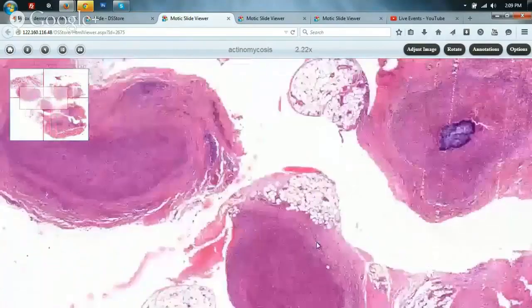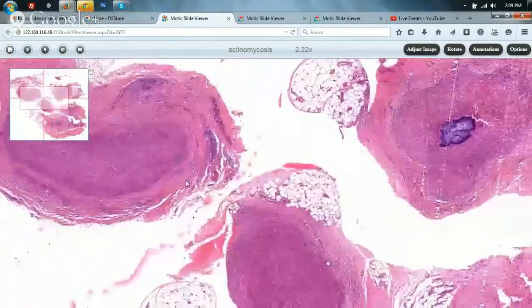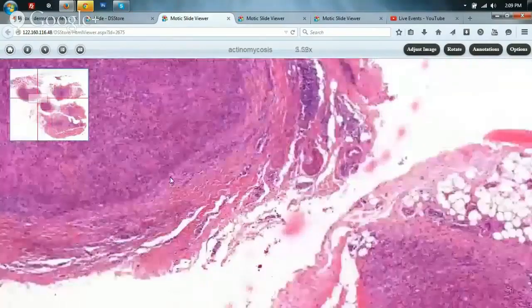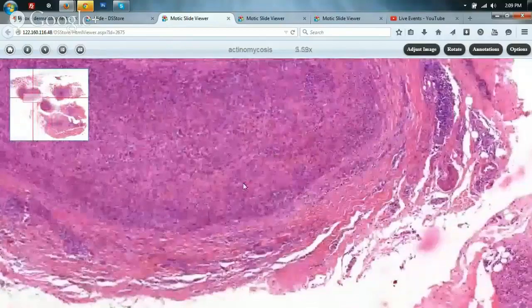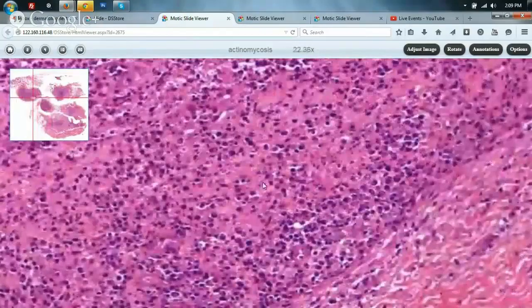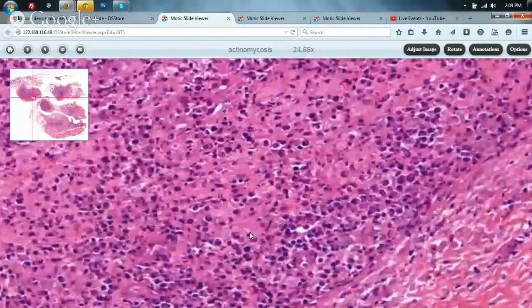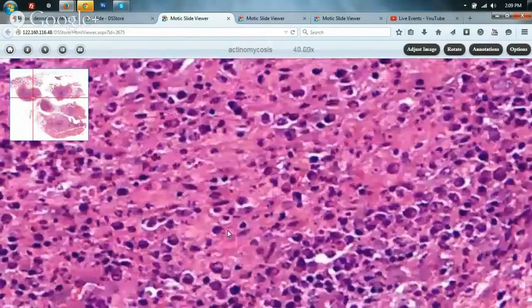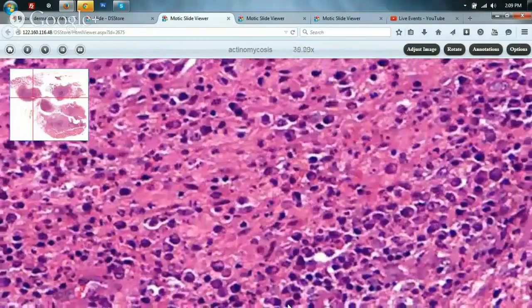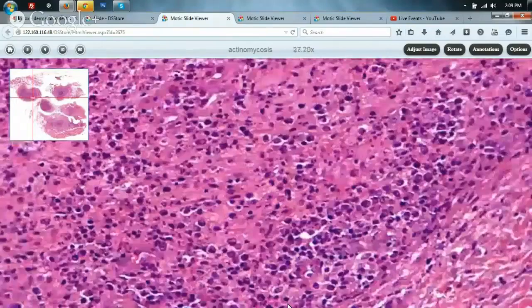We see small rounded collections which we call suppurative granulomas. By suppurative granuloma I mean the same granulomatous picture but with the addition of neutrophils. This granuloma contains not only epithelioid cells and histiocytes but also neutrophils and neutrophil debris to a large extent — hence the term suppurative granuloma — and they are all enclosed by a fibrotic shell. Fibrosis is a very typical feature of healing in mycotic skin infections.